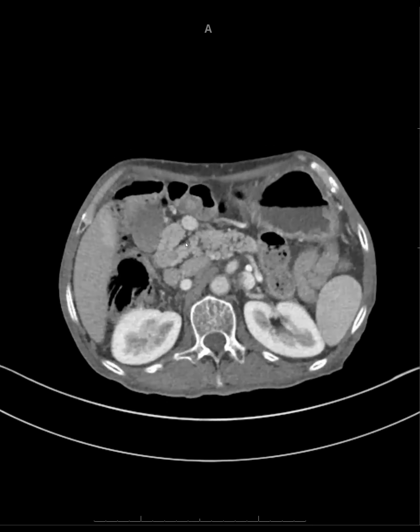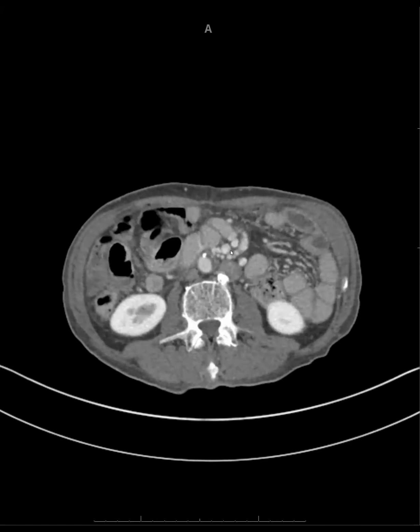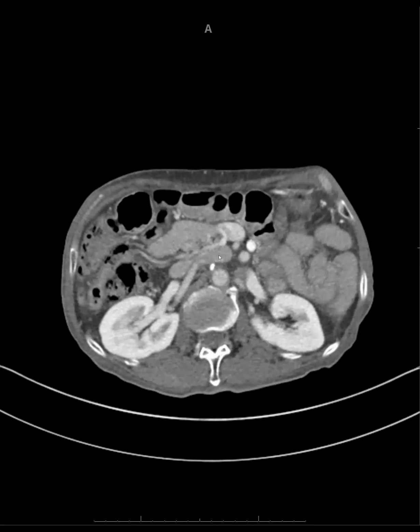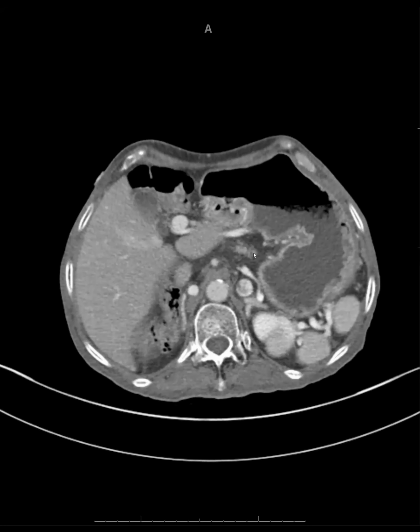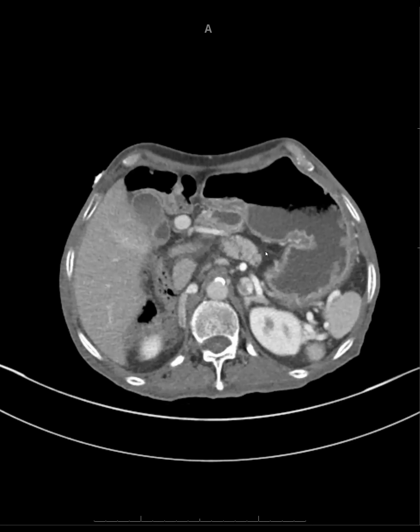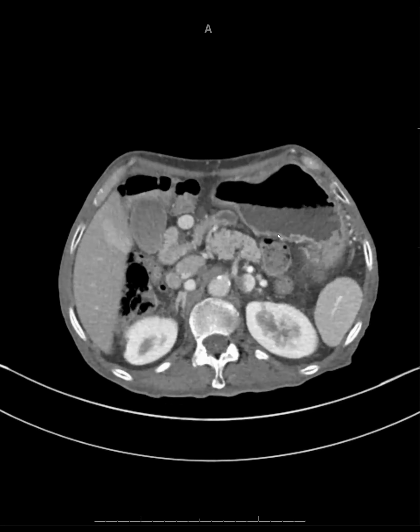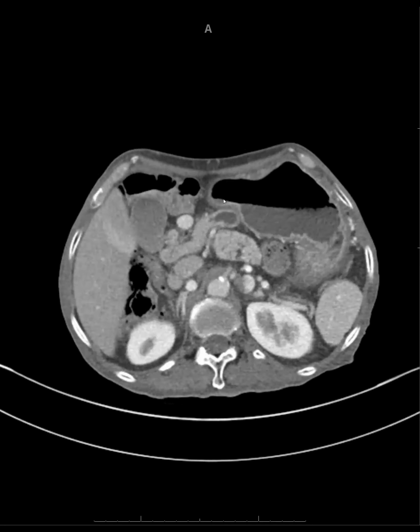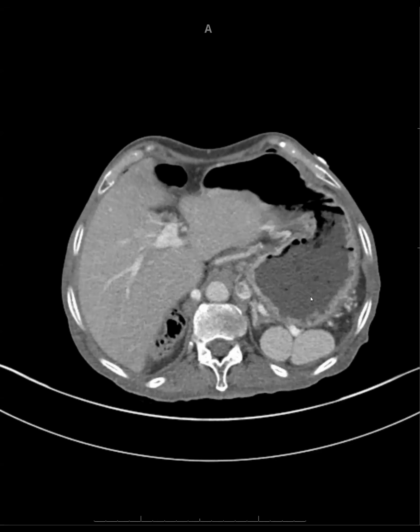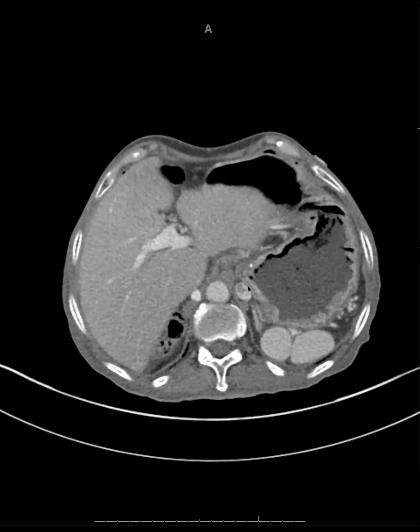What is this? Some kind of, I know it's that sequence of polysplenia, truncated pancreas, left-sided IVC, but I don't know the name of it. Yeah, so it's left isomerism or a heterotaxy syndrome. So we've got two left sides, like we've got multiple spleens and a left IVC.